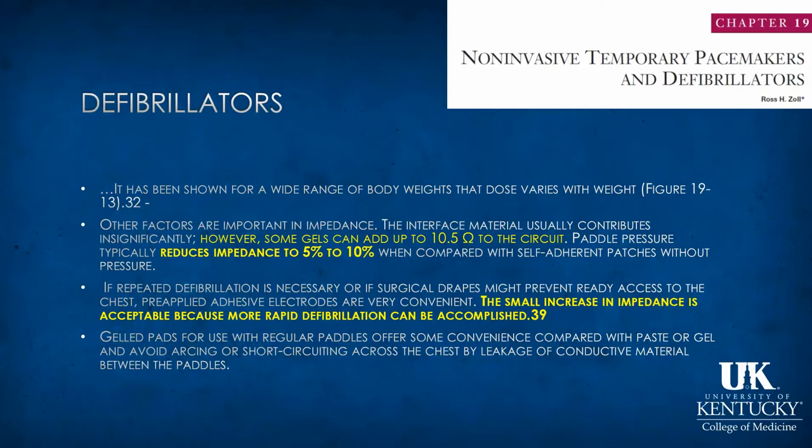Going back to impedance, the interface material can add resistance to the circuit, and increased paddle pressure usually reduces impedance by 5 to 10%, as compared to the self-adherent patches without pressure. So we put these defibrillator patches on, and it probably is not obvious that they may not be as effective as external paddles.